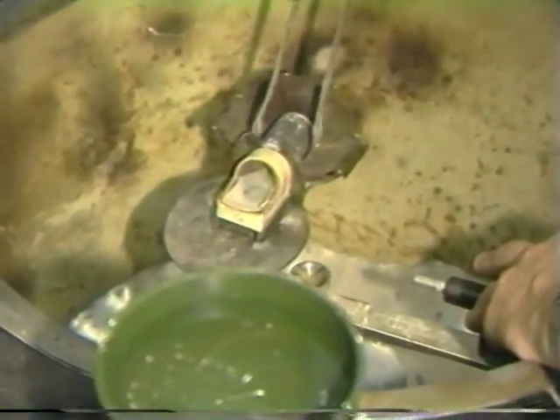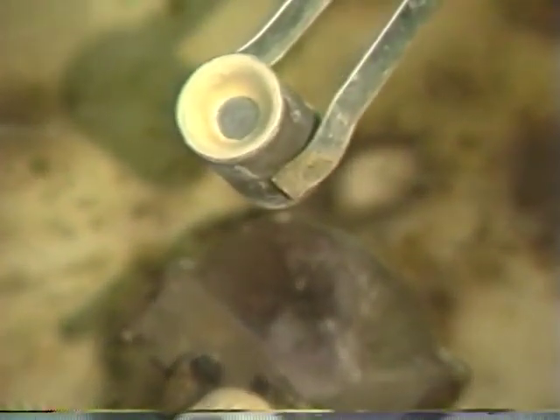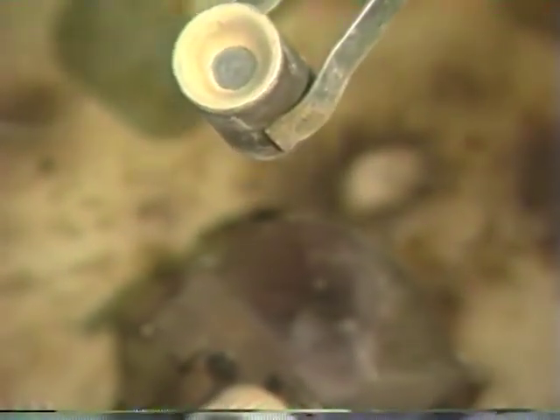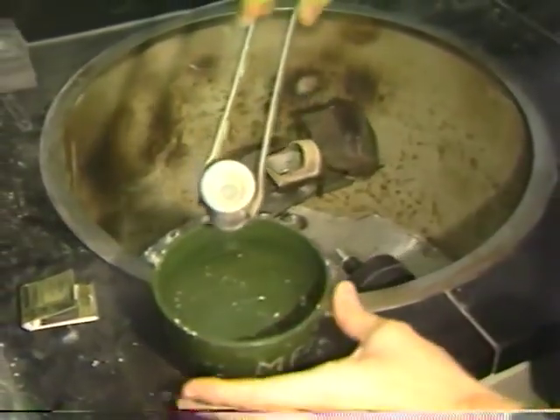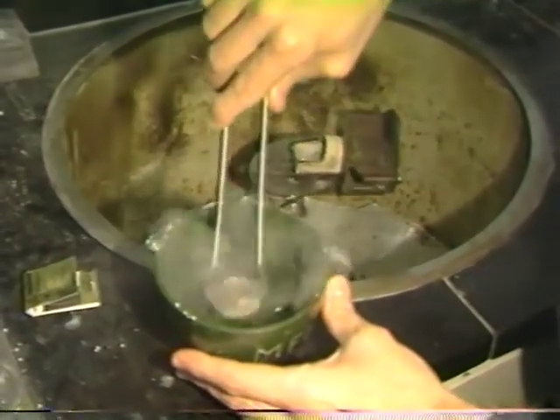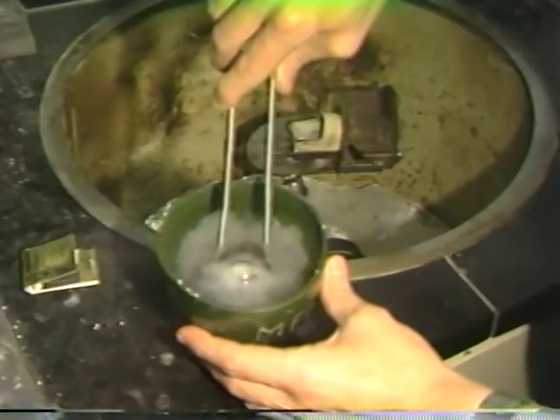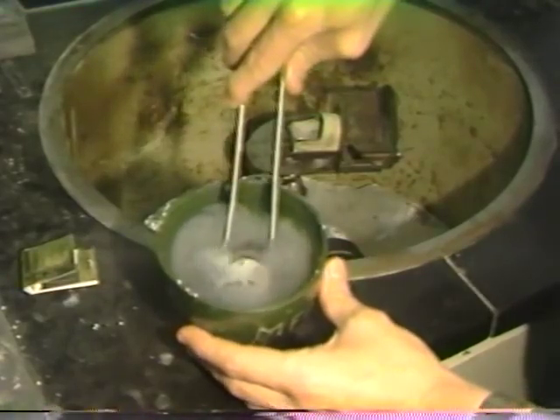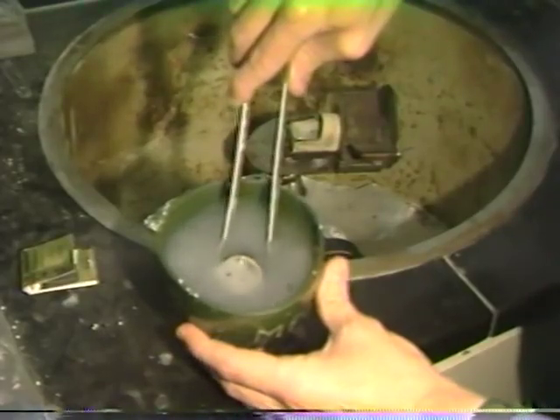Once the machine has come to a complete stop, the tray is pulled forward and away from the ring. The ring is removed and inspected to make sure that we have a proper button. The ring is then quenched in some water. Make sure to hold a rubber bowl underneath, simply because you want to be able to retrieve the casting. When doing this in a sink, please throw the investment in the trash can rather than in the sink.